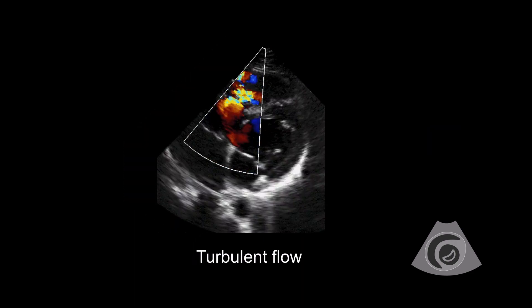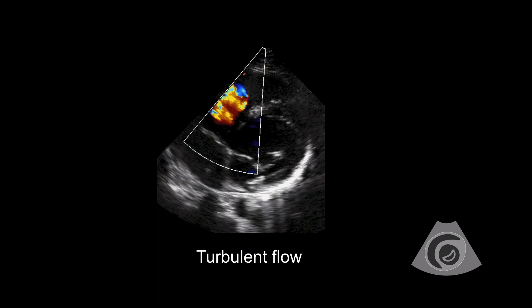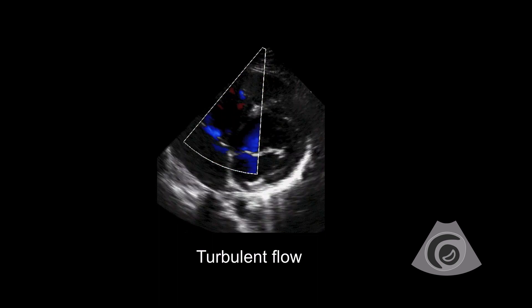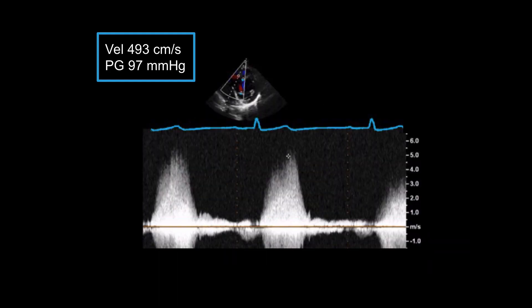Now we can see turbulent flow at the site of the muscle bundles. Let's take a look at the gradient — whoa, that's a high gradient. There is a danger here that if this gradient gets higher, such as with exercise, it will cause the high pressure chamber to reach systemic pressures and the flow of the ventricular septal defect will reverse, which means the flow will go from right to left causing cyanosis, and warranting surgery to resect the muscle bundles and close the ventricular septal defect.